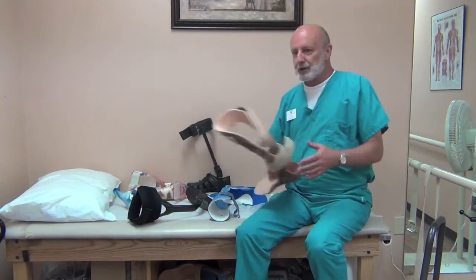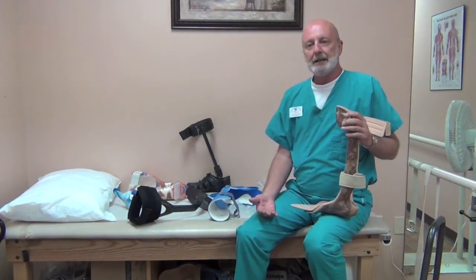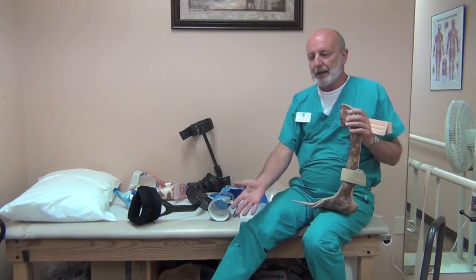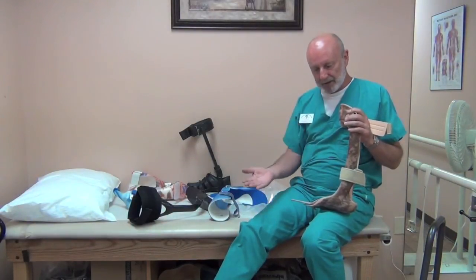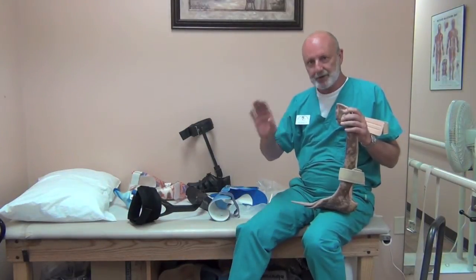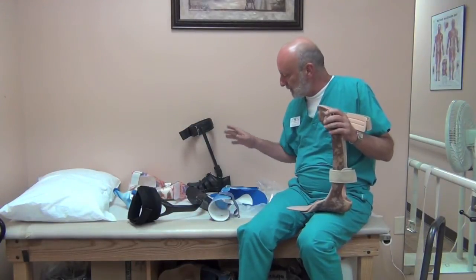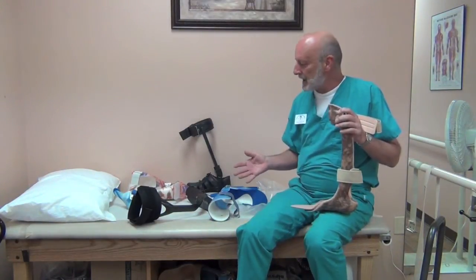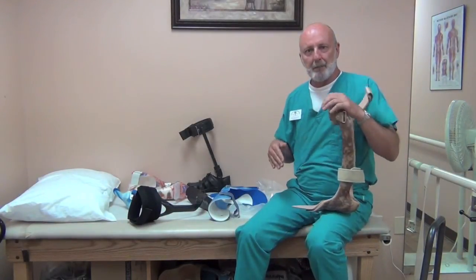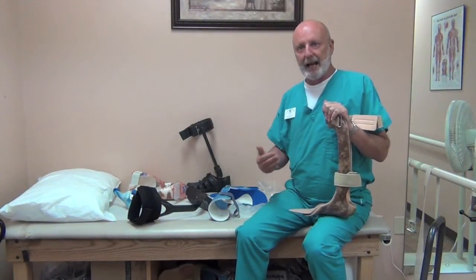If you have drop foot in conjunction with other weakness — say a back injury or nerve damage — where you have not only weakness of the dorsiflexors, the muscles that pick up the foot, but also the plantar flexors, the push-off muscles, then you would not want to use any of these designs. In my opinion, the plantar flexors — the push-off muscles — are actually more important even than dorsiflexion for effective gait.